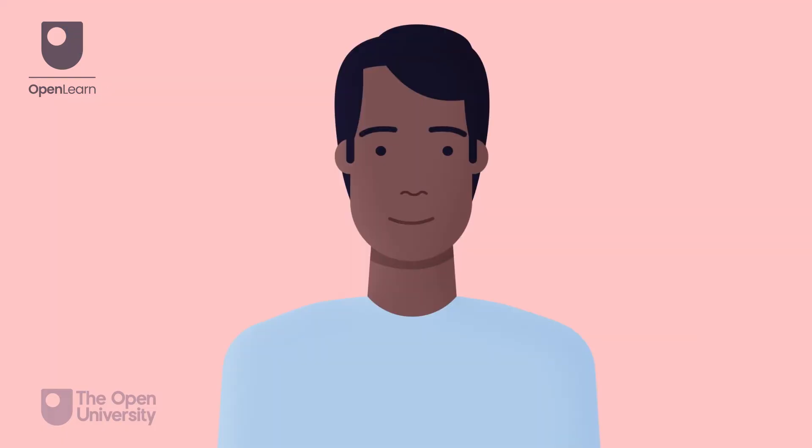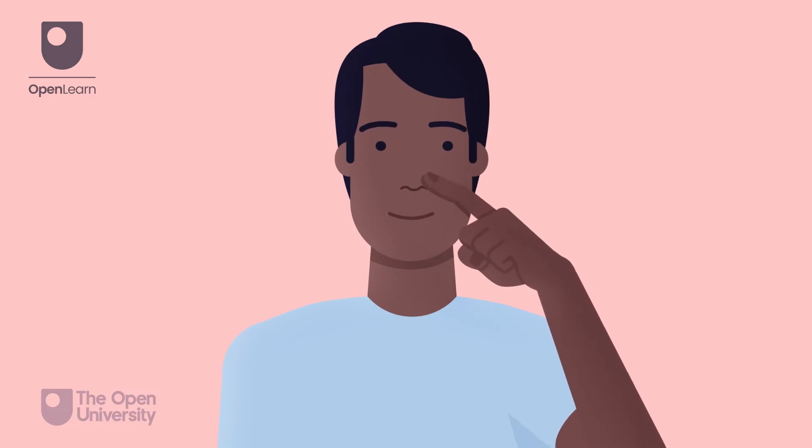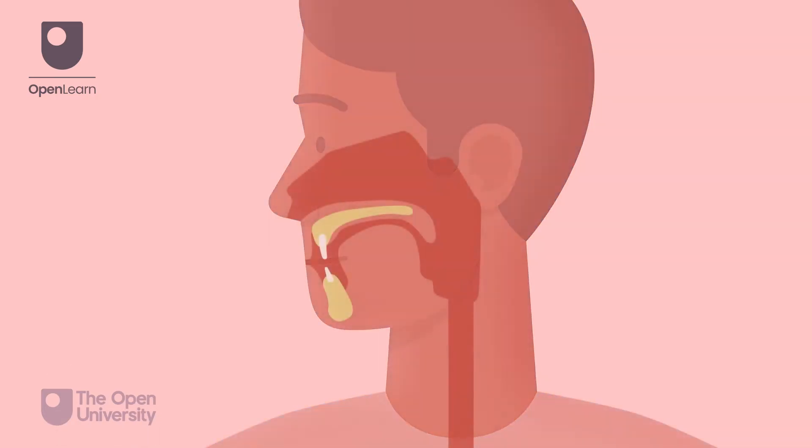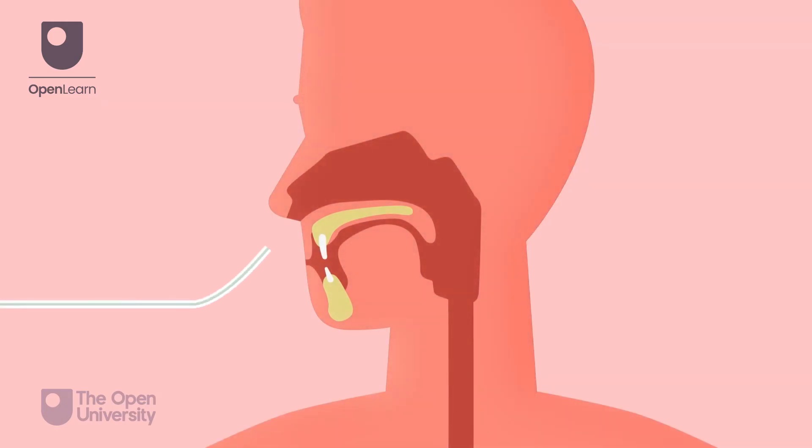Check the nostrils are patent by asking the person to sniff with one nostril closed, and repeat with the other nostril. Introduce the tube into the person's preferred nostril, sliding backwards and inwards along the floor of the nose to the nasopharynx.